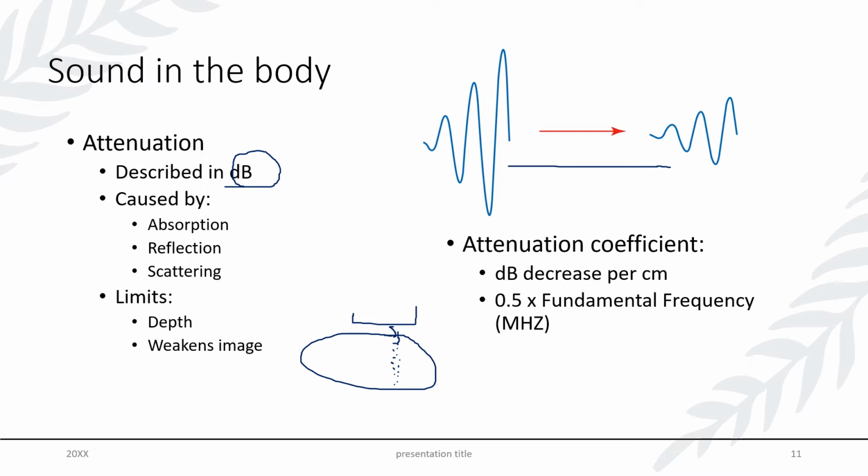If we're looking at it on the attenuation end within the body, we actually have a significant negative decibel change because we have a decrease in amplitude as it penetrates through the body. Now that decrease in amplitude is caused by the interactions of the sound waves within different materials of the body, as I mentioned. So as my sound wave comes in, it hits a media with a new propagation speed. Some of that sound is going to be reflected.